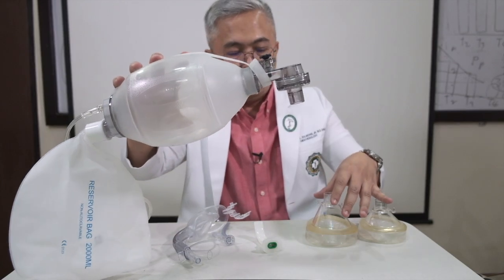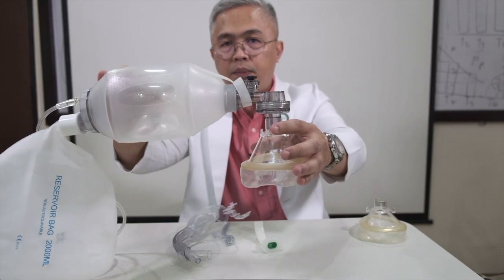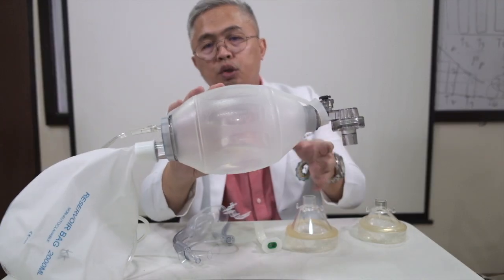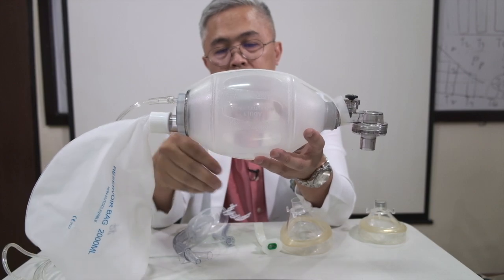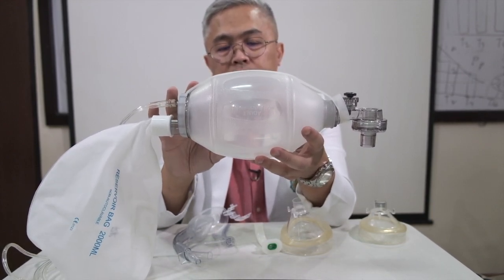So what you use this for is to connect this to your patient's mask and bag your patient. I think you need to be familiar with this tool because chances are this is what you're going to see in the ward.